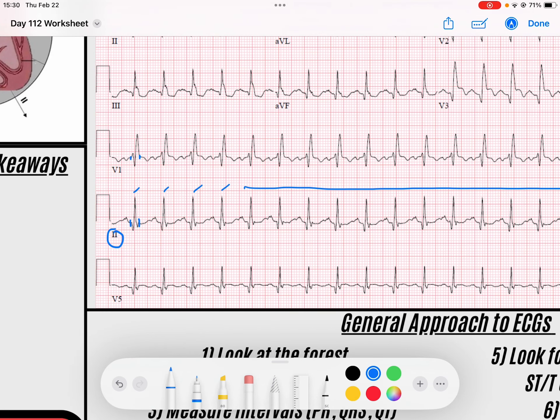My rate is, if I start here at a solid line: 300, 150, that would be 100. So closer to 150 — I would call this maybe 140 beats per minute. You could do a more precise calculation if you'd like, but I think this is appropriate.